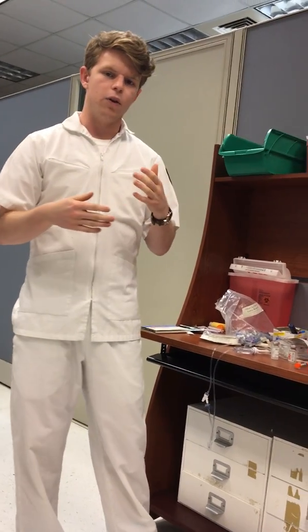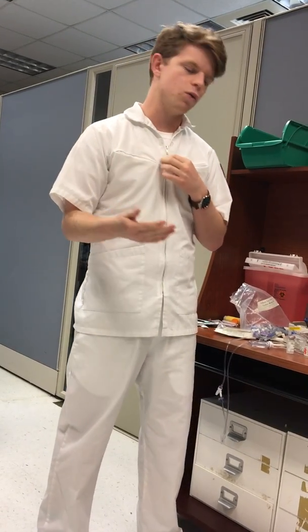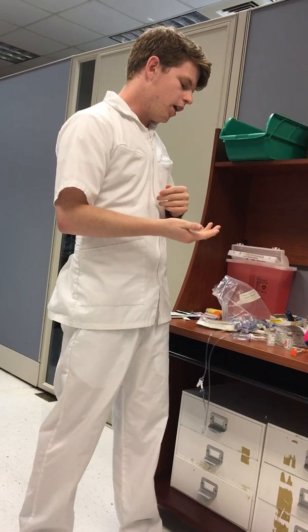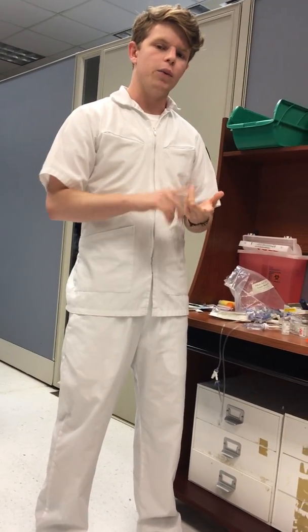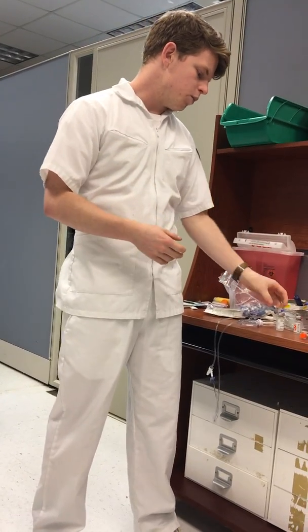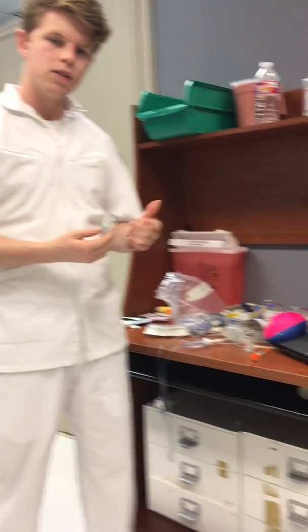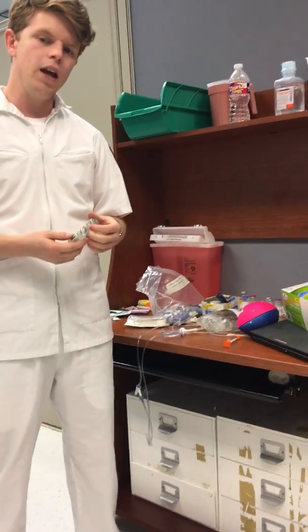So with the sliding scale, I would check the doctor's orders and see if it's a scheduled thing, then I would want to choose my insulin correctly, and I would want to make sure that I have the right amount of insulin. So for demonstration purposes, I'm going to need to mix 2 units of insulin. I'm going to be mixing NPH insulin and regular insulin.